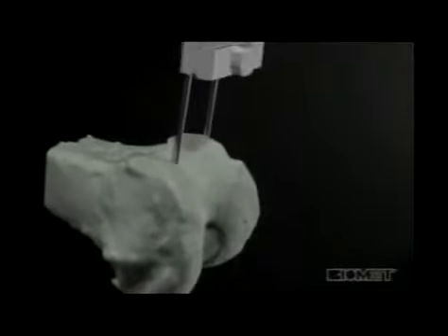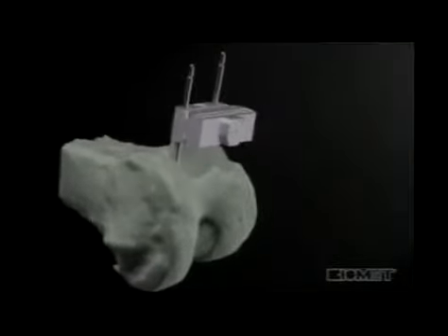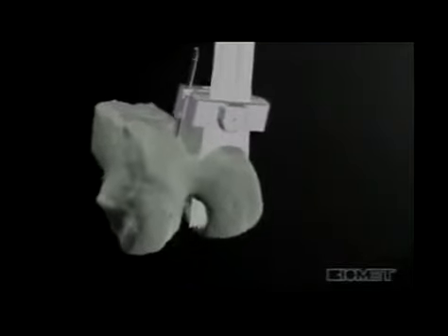And these are the implants we use in the OR. So these pins are used to anchor the alignment jig or the cutting jig. Now, people often ask with the knee replacement, you're not replacing the entire knee, you're just shaving off maybe an ounce or two of bone. This is actually a lot like putting a crown on a tooth. The muscles around the knee are kept intact, the ligaments are kept intact. The native bone, you try to preserve as much of that. You're just taking away the diseased cartilage.